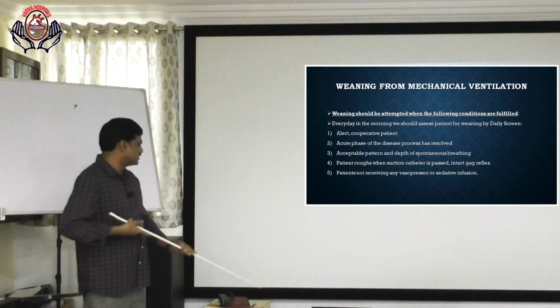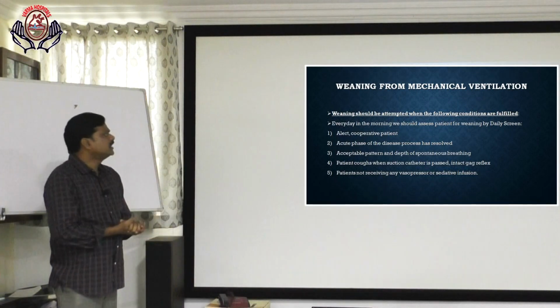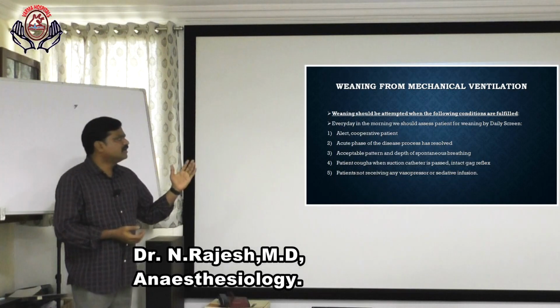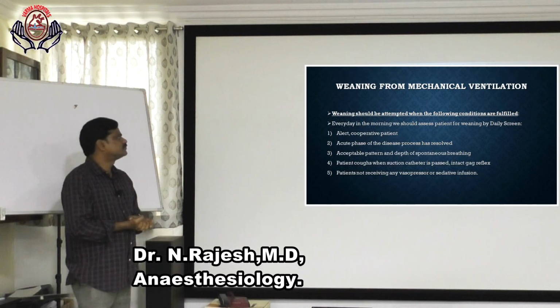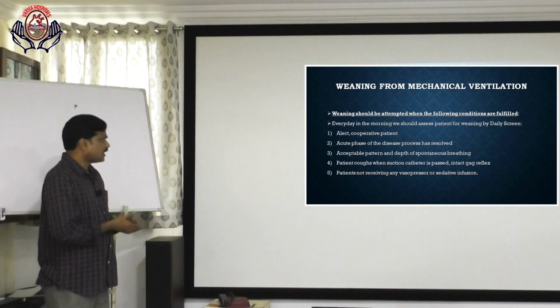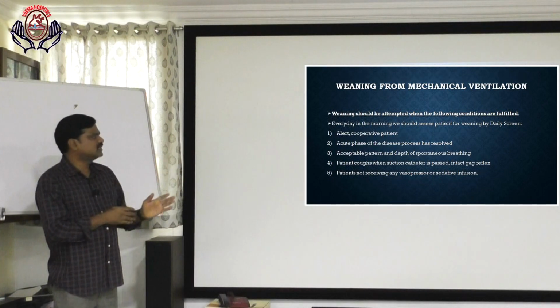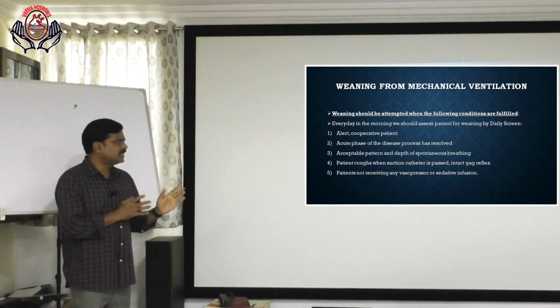Weaning from mechanical ventilation. Weaning should be attempted when the following conditions are fulfilled. Every day in the morning, we should assess the patient for weaning by daily screen: alert, cooperative patient, acute phase of disease process has resolved, acceptable pattern and depth of spontaneous breathing, patient coughs when suction catheter is passed, intact gag reflex, patient not receiving any vasopressor or sedative infusion.